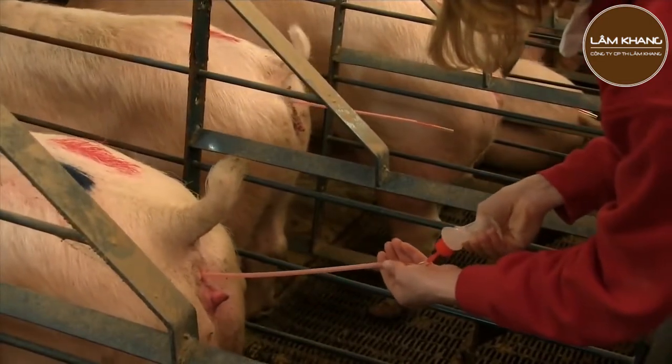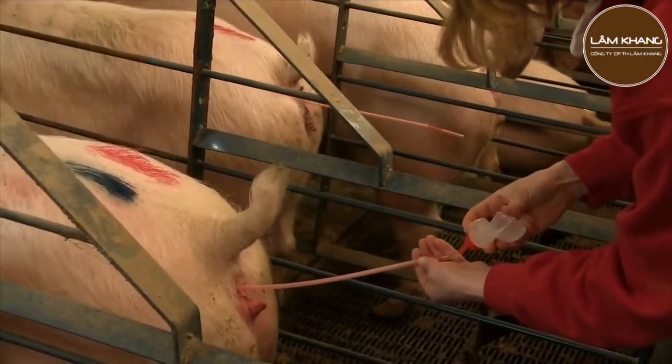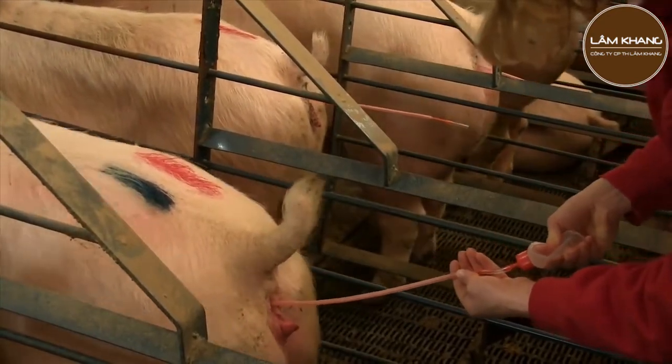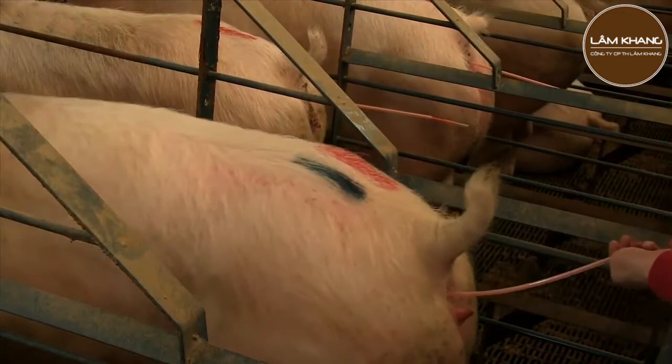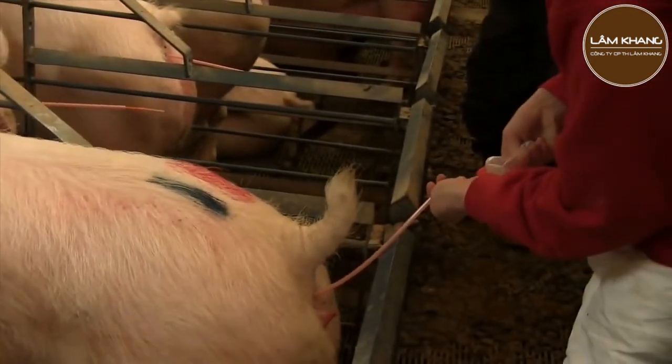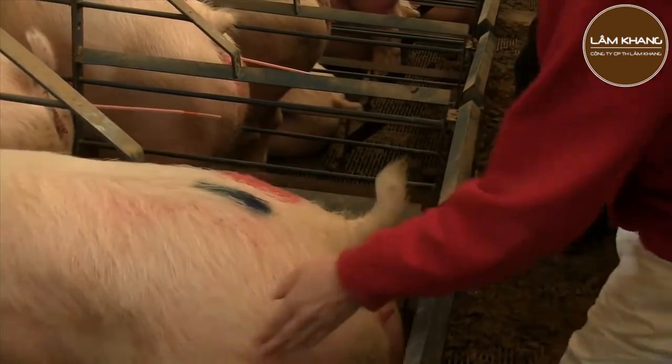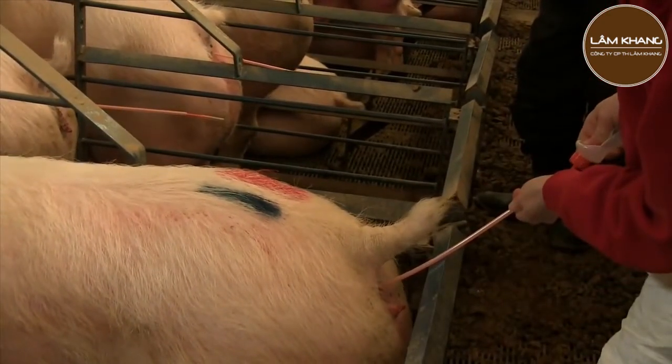Once the dose has been inseminated, the bottle or bag can be removed and allow some air to enter it in order to ensure that the entire dose is deposited in the sow. So you'll see here, I'll disconnect the bottle and allow some air to fill the bottle and flush the remaining semen in the AI rod into the sow.